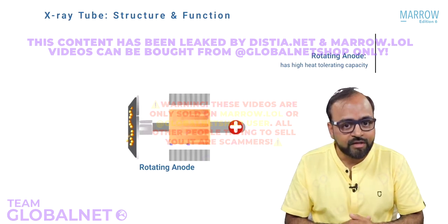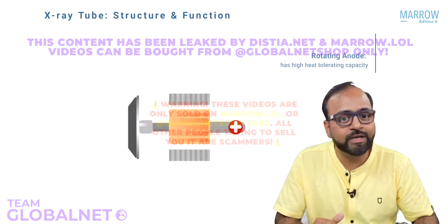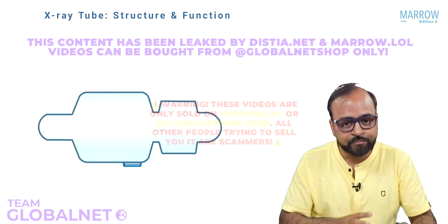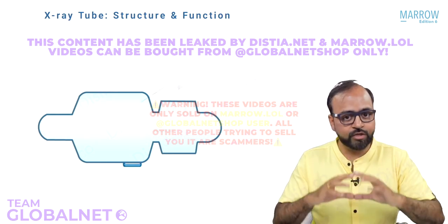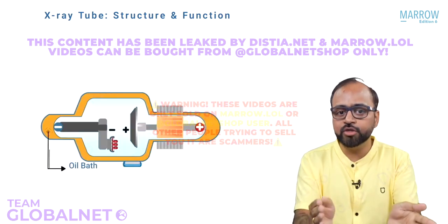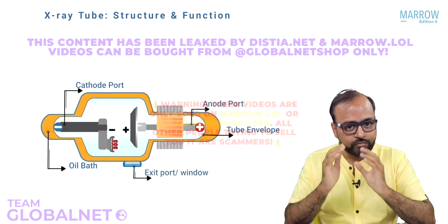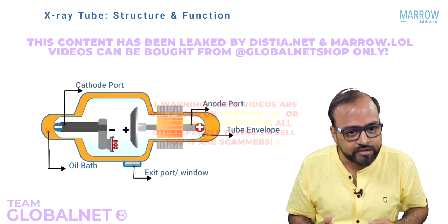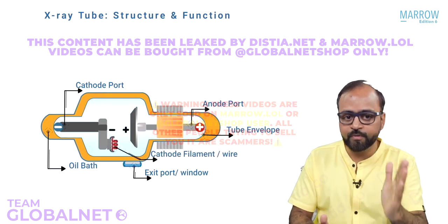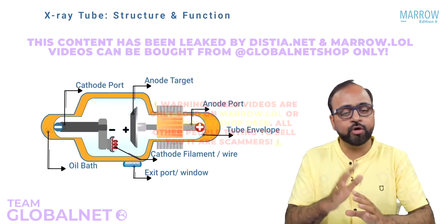Now we have seen until this point how an X-ray tube actually works. Right, let us quickly go back. Let us rewind and start from step 1. Look at this X-ray tube. It has a tube housing. We open it. Inside there is an oil bath, inside which there is a tube envelope. There is a cathode port, anode port. There is an exit window with filters and collimators. Inside the tube envelope there is vacuum. There is a cathode filament made up of tungsten. There is an anode target which is also made up of tungsten, rhenium alloy or molybdenum.